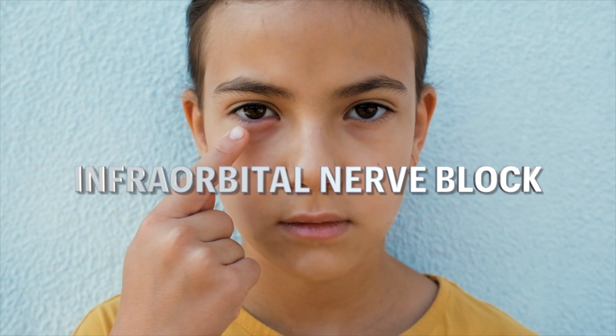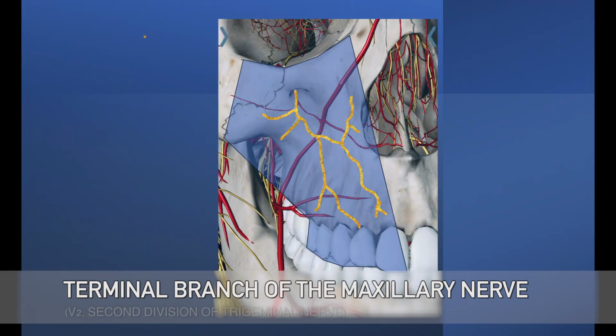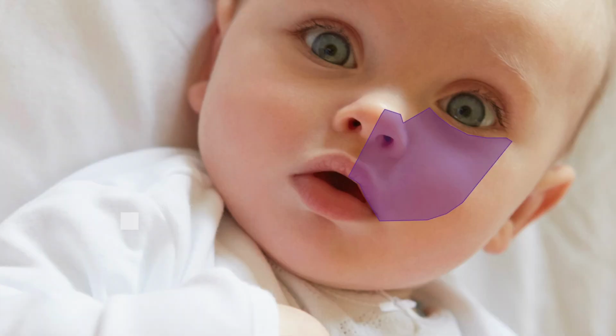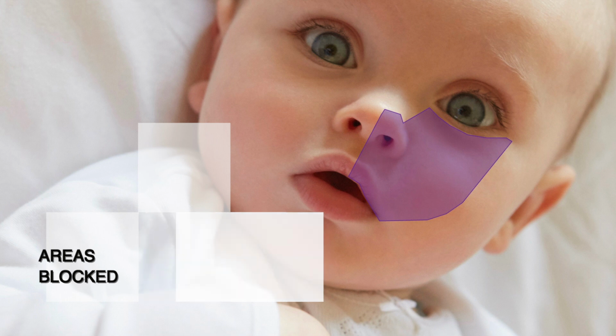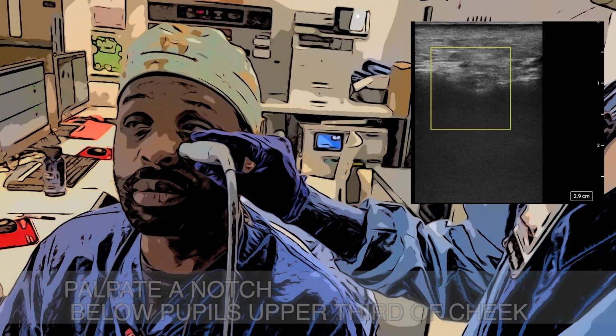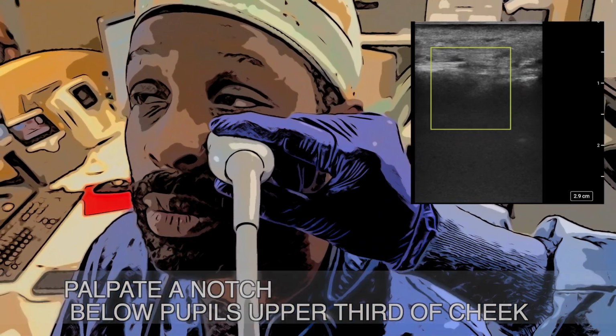This is the infraorbital nerve block. The infraorbital nerve is a terminal branch of the maxillary nerve, which is the second division of the trigeminal nerve. The areas blocked are the lower eyelid, the upper lip, cheek, lateral nose, and up to 4 teeth and gums from the midline. To find the infraorbital notch, palpate below the pupils on the upper third of the cheek.